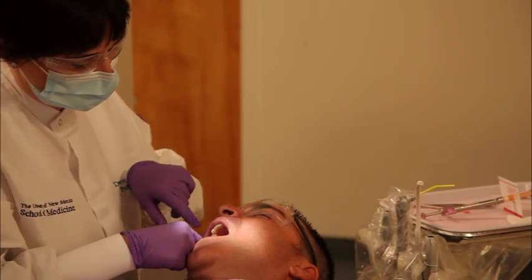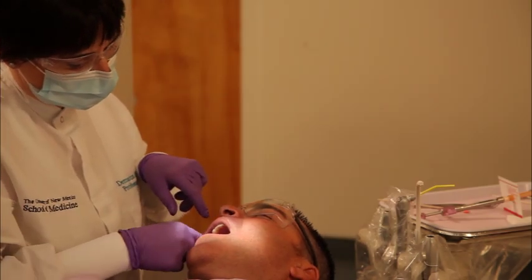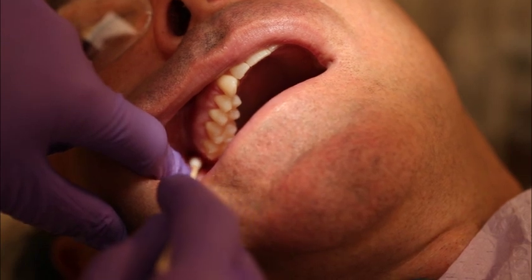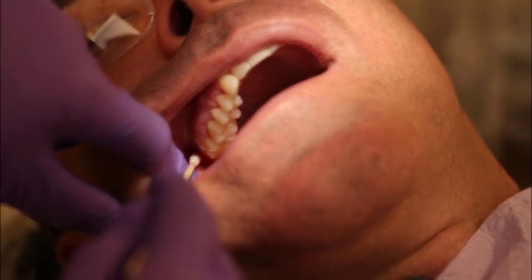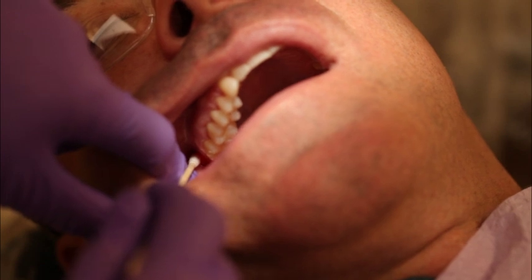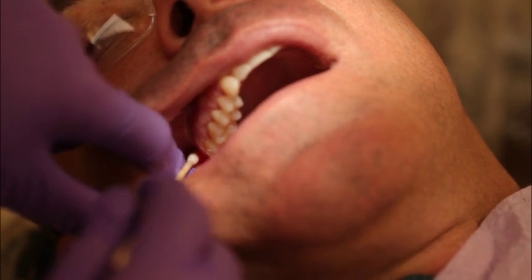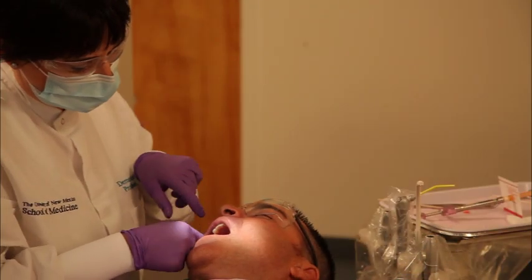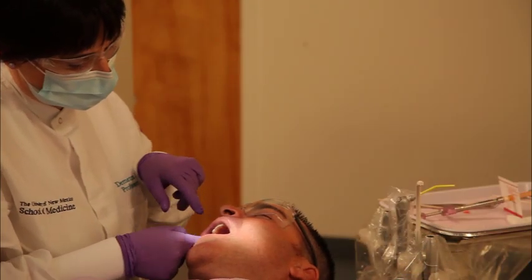Dry the penetration site and prepare the alveolar mucosal tissue with topical anesthetic in the vestibule at the height of the mucobuccal fold superior to the apex of the maxillary second molar. Topical anesthetics are most effective for patient comfort when applied for 1 to 2 minutes. Dry the tissue to remove any excess topical anesthetic.